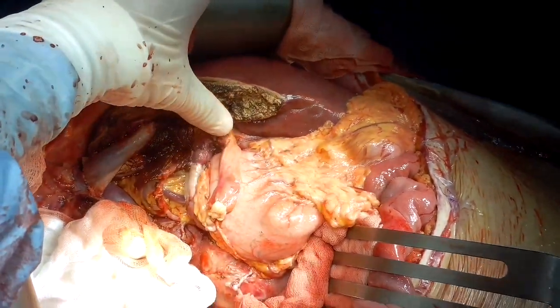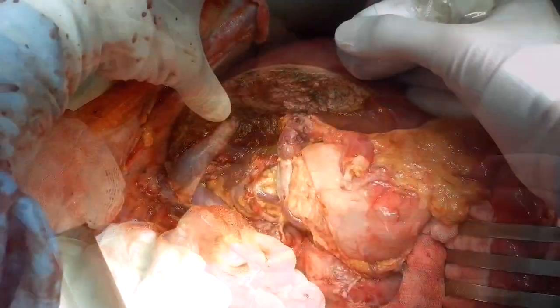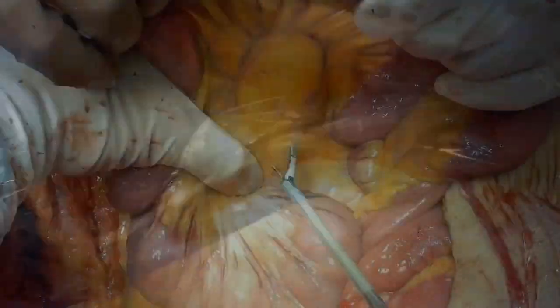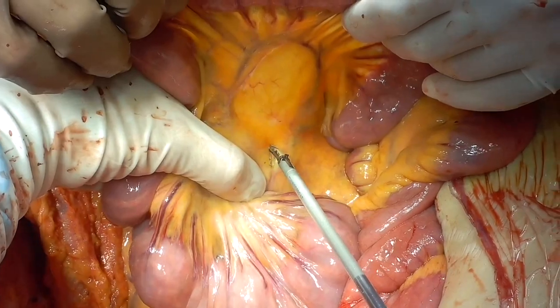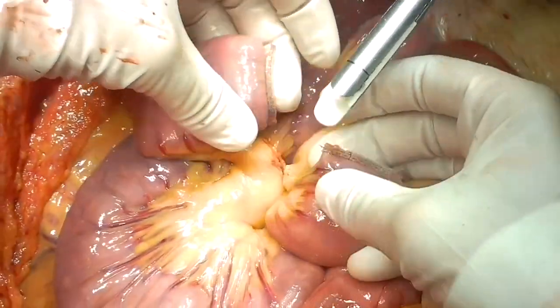The liver autograft is fully revascularized and appears good. After assessing the liver blood flow with ultrasound, we can proceed with a Roux-en-Y loop in order to perform biliary reconstruction.